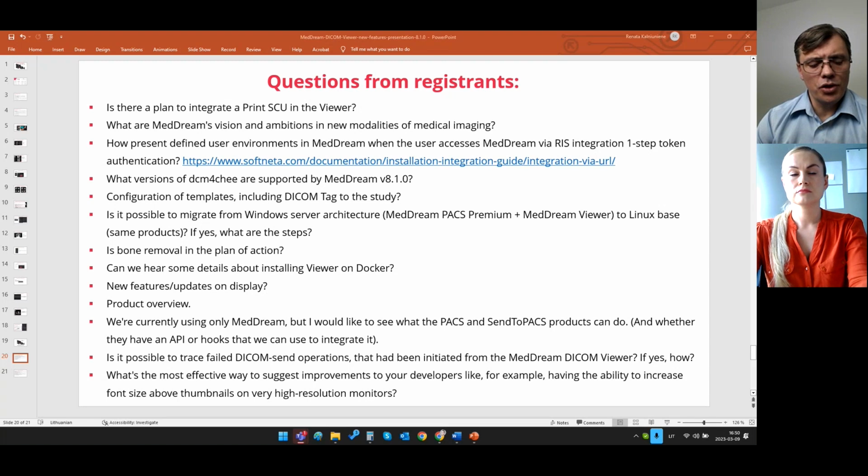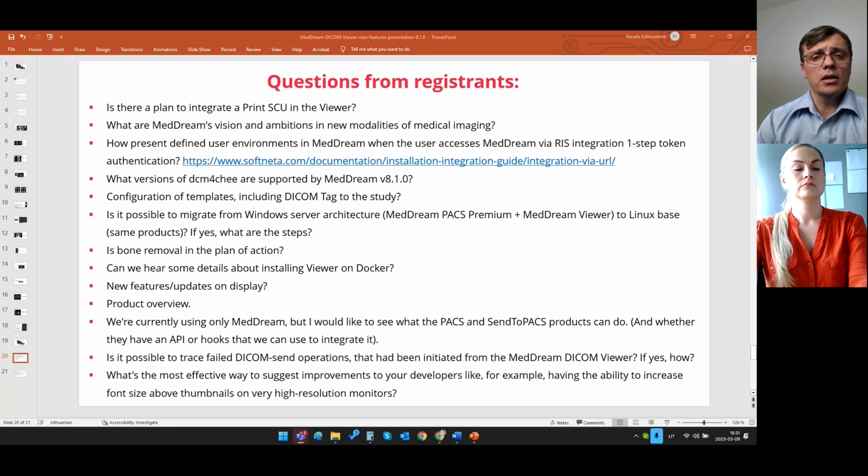Yes, the migration would be quite complex because you would need to regenerate licenses. First of all, our licenses are neutral at the beginning, but when you deploy and activate them, they will be locked to your infrastructure, including operating systems. So the first step, you would need to regenerate the licenses. Secondly, it would be quite complex because you would need to import the database for our PACS system when you move to Linux. And definitely you would most likely need our engineers' assistance.